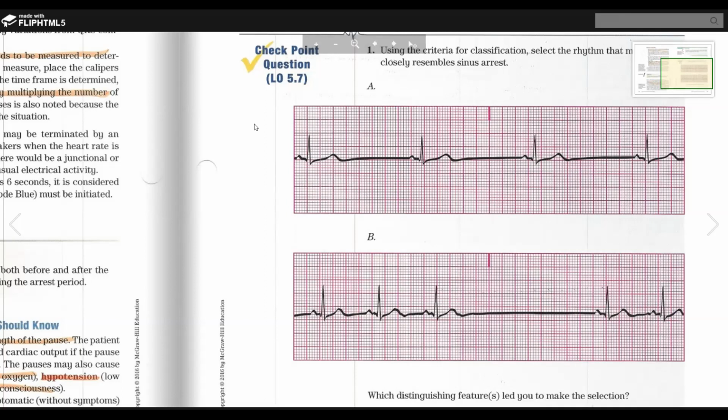Why did you say you did 13 times 0.02? Because 1 little square is 0.04. So where do you get the 0.02 from? I don't know. I think that's what he said to multiply by. O sea que venga le preguntamos.